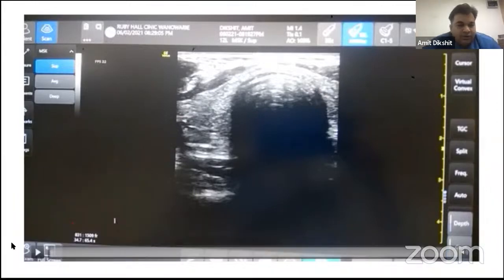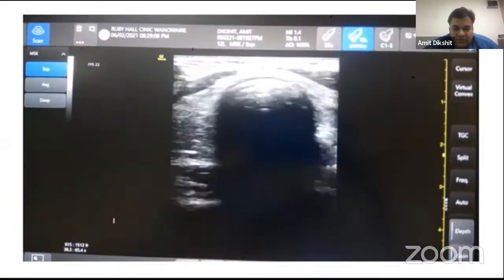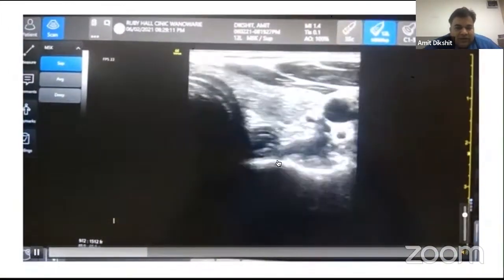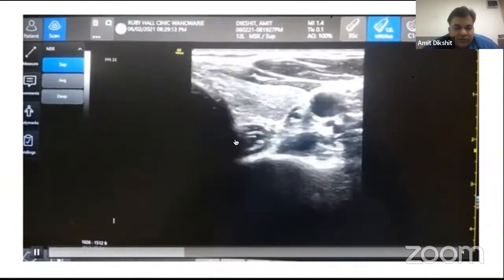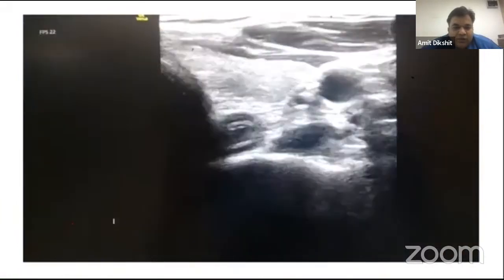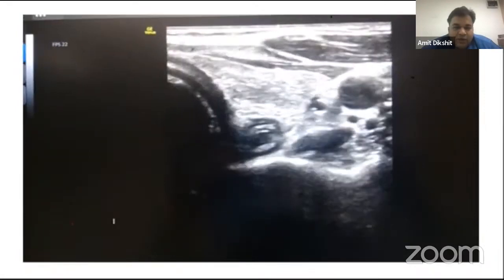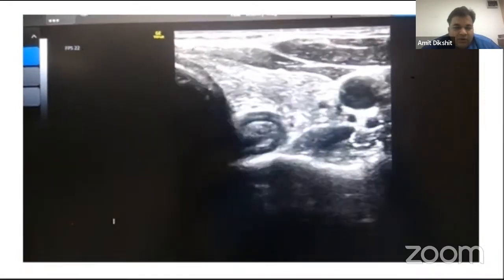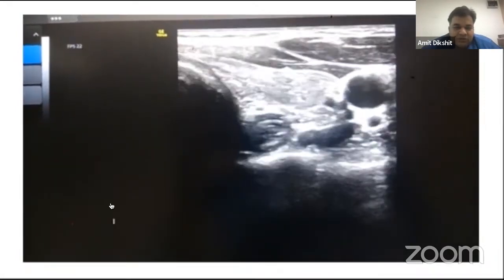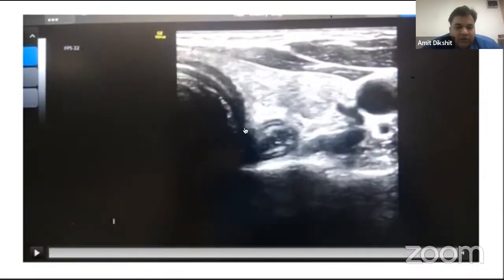Yeah, sorry. So that's the trachea. You can see the trachea there, and on one side the esophagus is nicely seen. Most of us think that the esophagus is exactly posterior to the trachea, but here it is posterolateral, and there are papers on this anatomy. Nobody can miss the esophagus; it is round, and you can ask the patient to swallow. There is also the tracheoesophageal groove, where the recurrent laryngeal nerve lies.